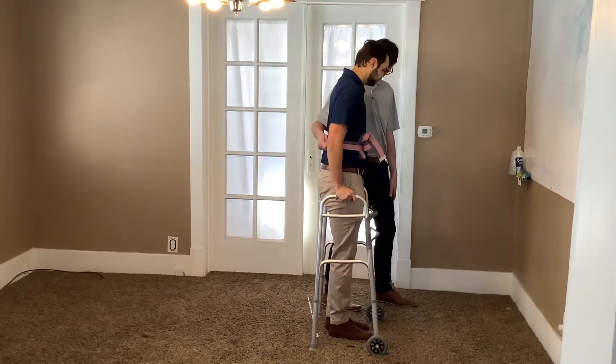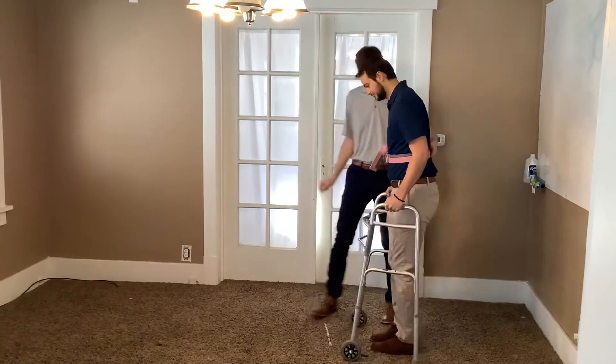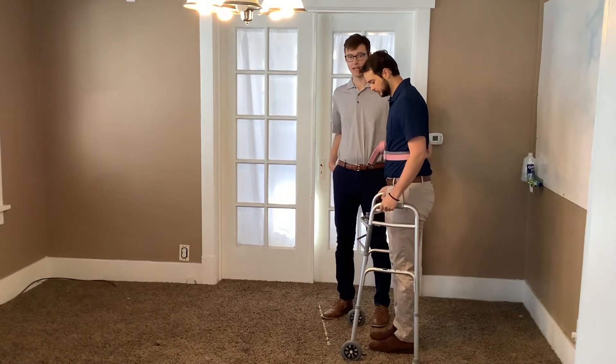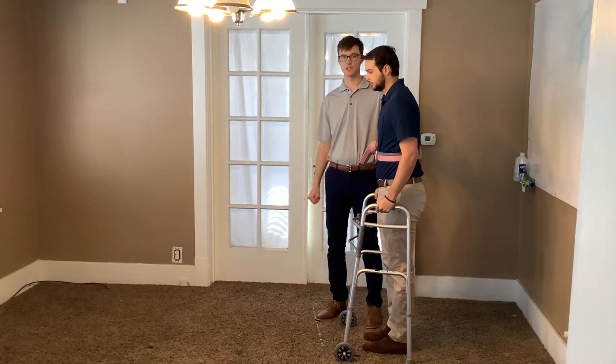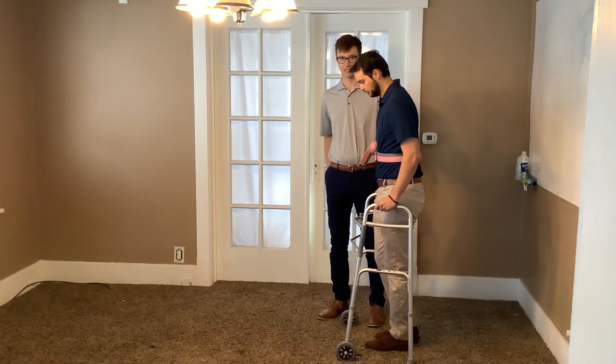Well done. Okay, now we're going to turn around facing the camera. So now we're going to say that the right leg is the affected leg. We're going to do a three-point modified gait, which can be used for toe touch weight bearing, weight bearing as tolerated, or any weight bearing precautions.